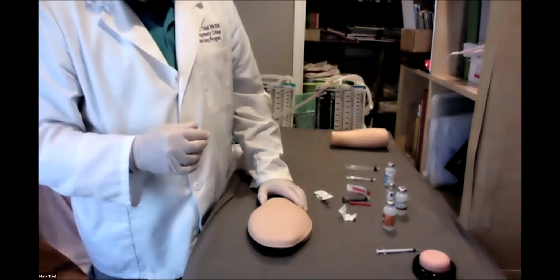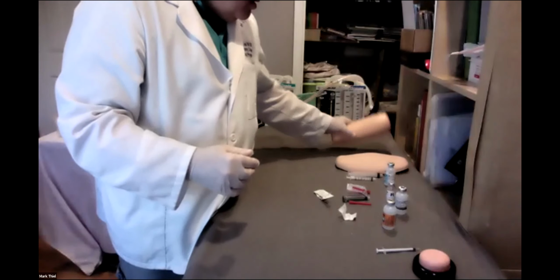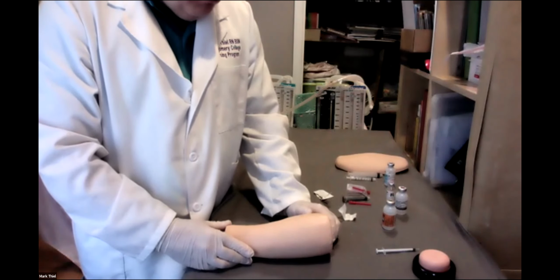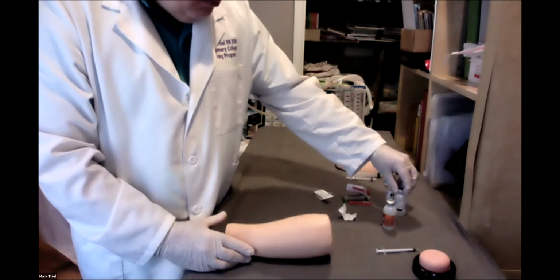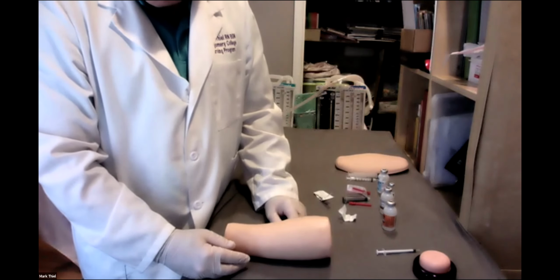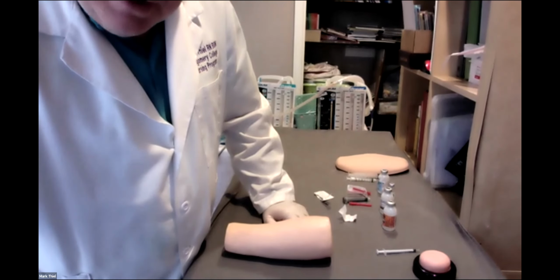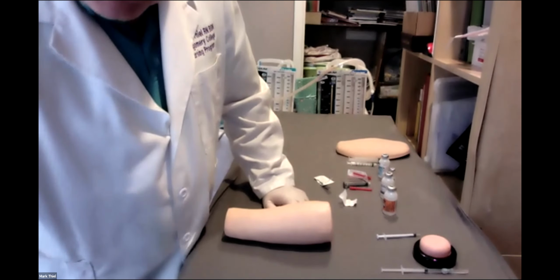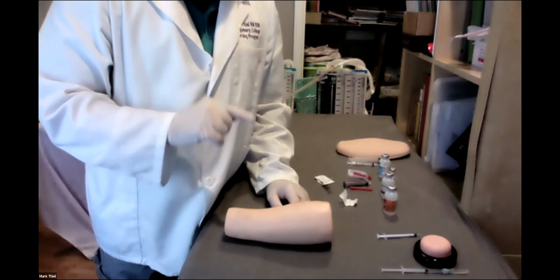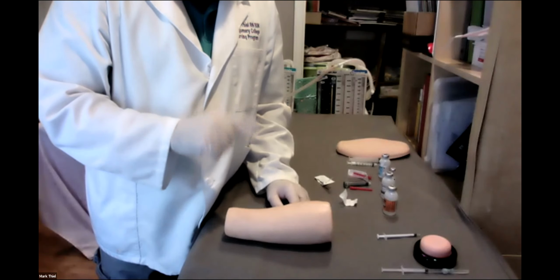You have completed the sub-Q injection. Lastly is our what? Our intradermal. What do we administer intradermally only? Something that we all have received is our tuberculin test. Tuberculin test is not the thing that is written in the EMR. The EMR will read PPD.